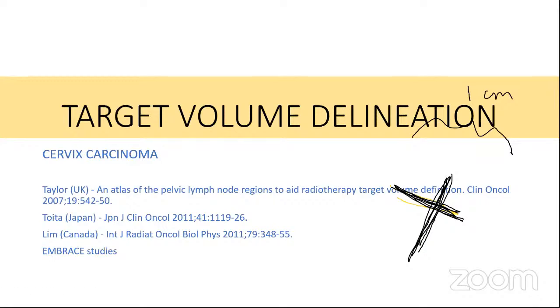now let's come on. I think I need to clear the annotation here. Let me clear it.